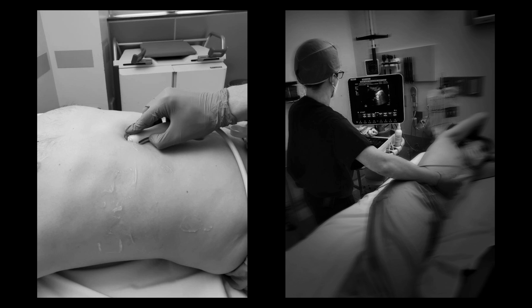So with that said, that's our patient and machine, or our probe and machine settings. We talked about the patient positioning. So let's dive into the different windows, right? There are 5 different windows that I want to talk about today. 4 of them the heart, 1 of them the IVC, that are going to help us get a 3-dimensional perspective on the heart.